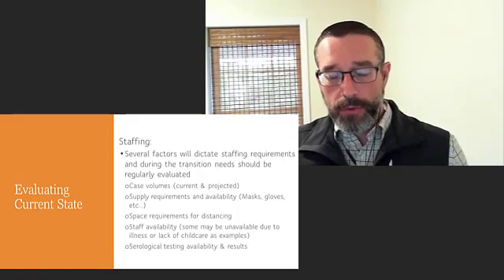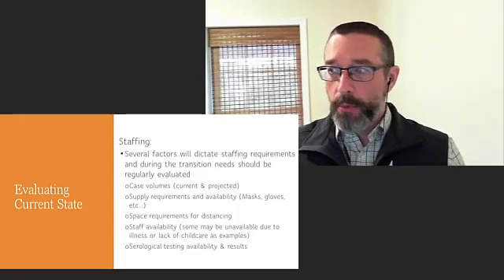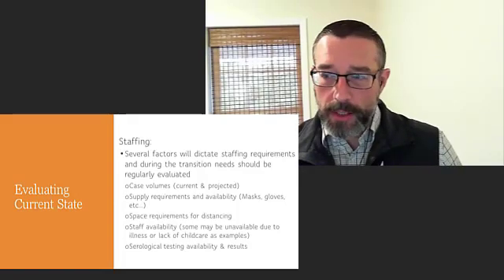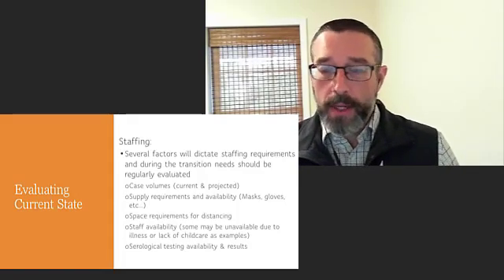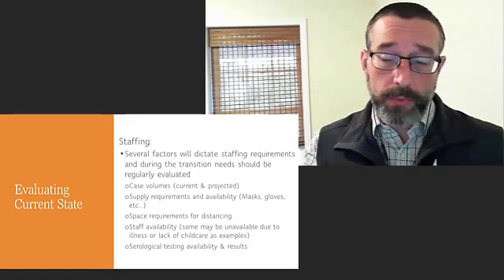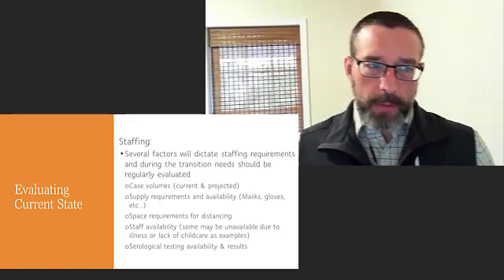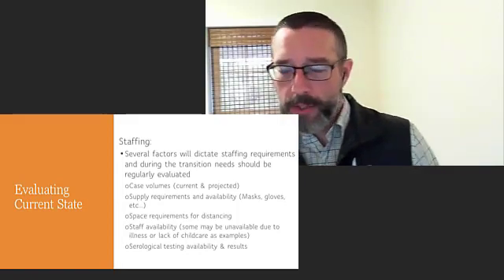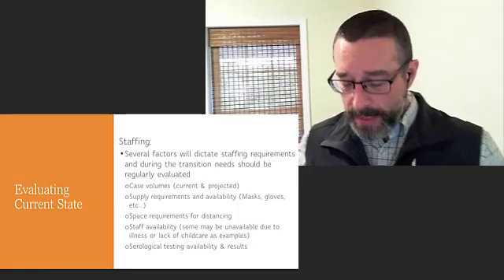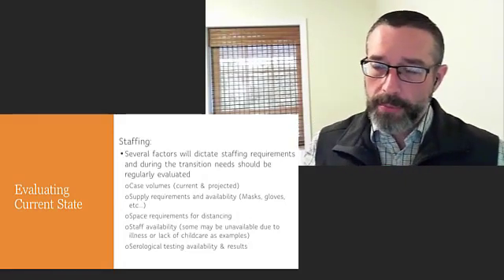And depending on your volume and that increase, you may need more now than you have. You may need more in the future. And the real question is, how robust is your supply chain to be able to even get it? And if you can't, that has to be considered by your facility as to whether or not they're ready to ramp up or to bring this back. Space requirements for distancing, and we're going to talk about some good options for that, as John mentioned. Because you're finding that if your state is opening back up, as they say, there are still guidelines for social distancing that have to be adhered to.